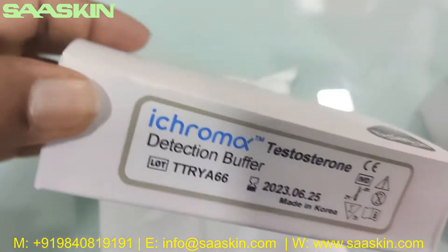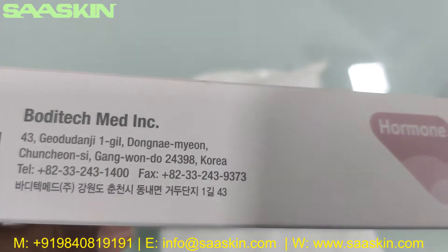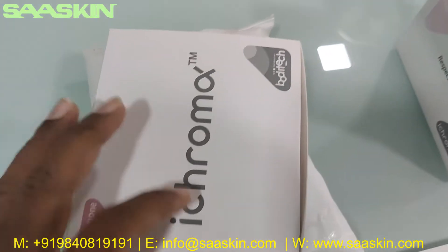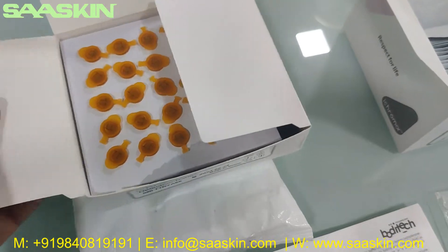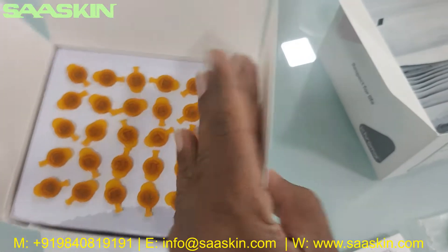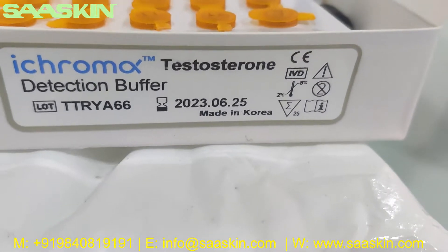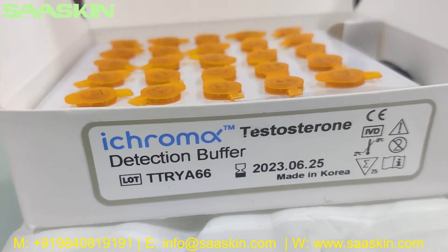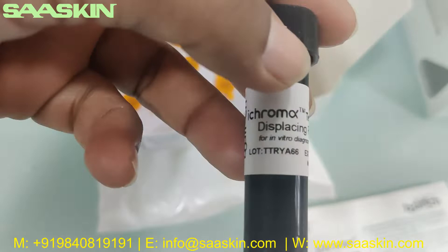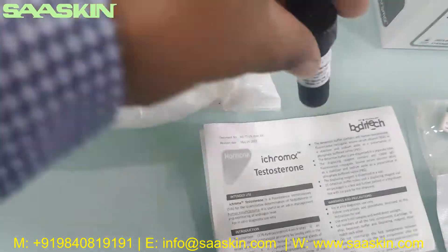Let me move to the other box. This is the i-chroma box — basically the reagent pack for the 25 test cartridges. For the 25 tests, you get one reagent bottle and 25 detector buffers. Let me pull out the reagent first — you can see this is the displacing reagent for the testosterone. You get one bottle of that.